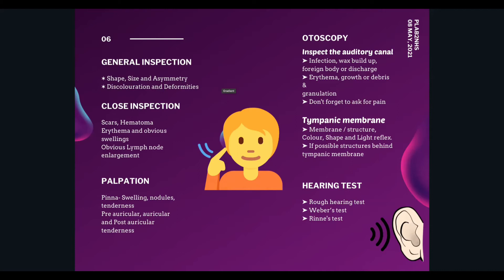Insert the otoscope a little more to visualize the tympanic membrane. First comment on color — pinkish gray is normal, pearly white is normal, red indicates infection, and scarring can indicate tympanosclerosis. Then look at the structure: comment on any perforation, grommet insertion, or bulging. Bulging indicates infection; if the membrane is retracted, this suggests Eustachian tube dysfunction.